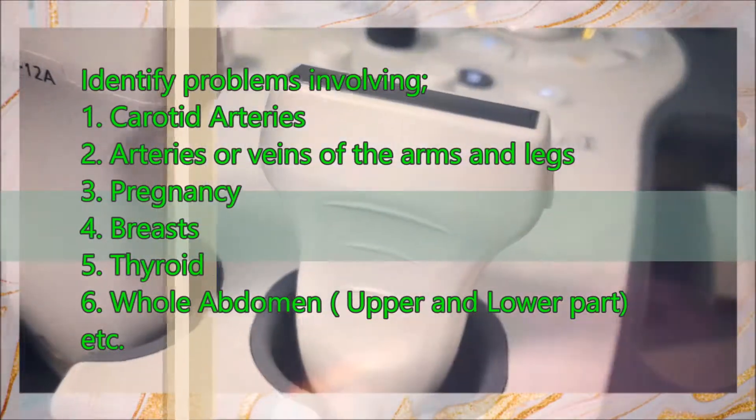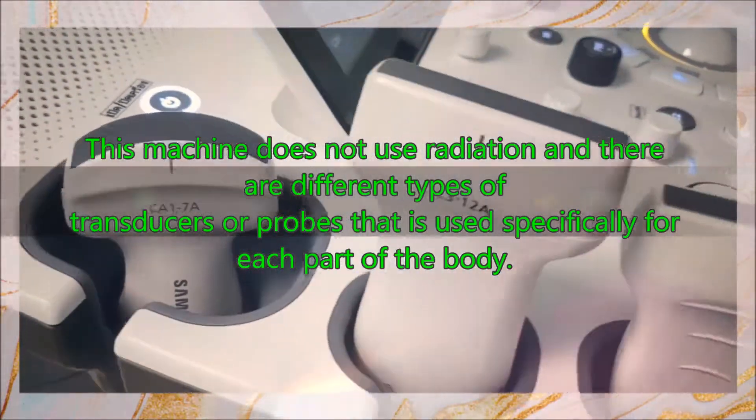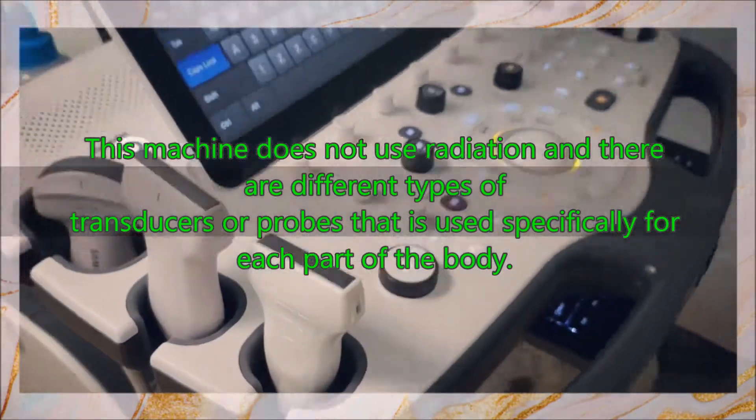It may also be used for the breast, thyroid, whole abdomen, and many more. This machine does not use radiation, and there are different types of transducers or probes that are used specifically for each part of the body.